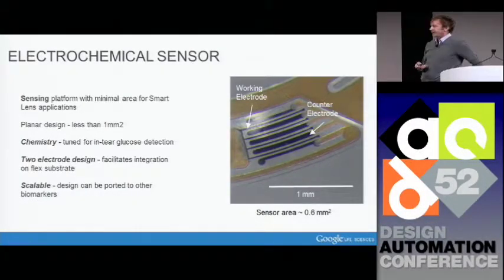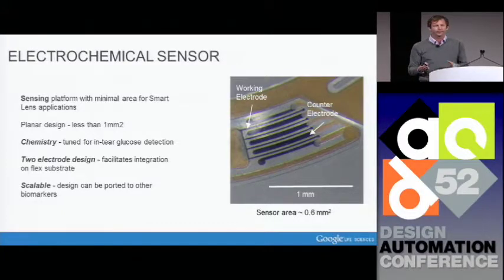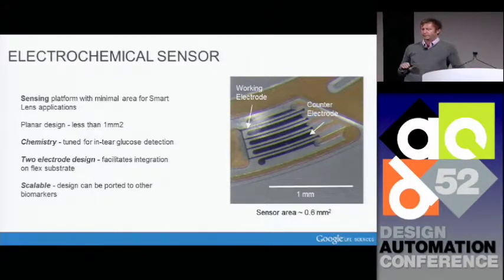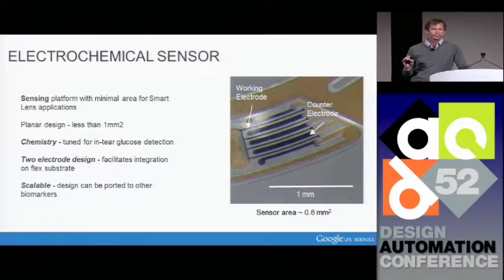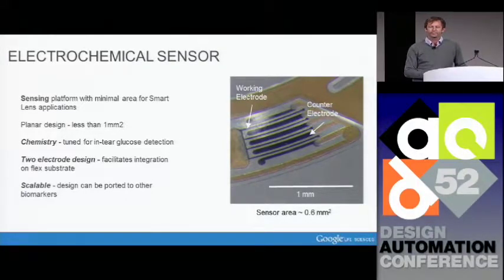Well, that's the integrated circuit, and we're all familiar with how to do that. But it's also a lot of fun looking at the interface. How does that circuit actually get information from the human body in the first place? The approach that we've taken here is that we actually want to do a true electrochemical measurement on the surface of the eye. It's important to note that this is not an indirect, say, optical readout of the glucose signal from the eye. This is a direct electrochemical measurement that's performed on the surface of the eye.